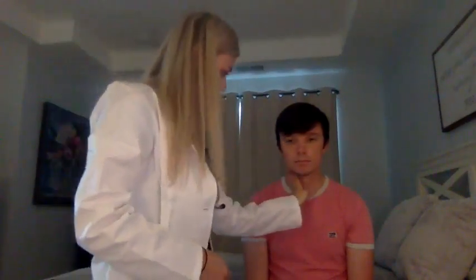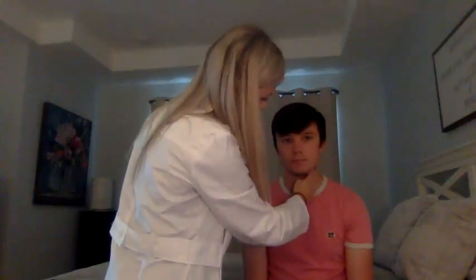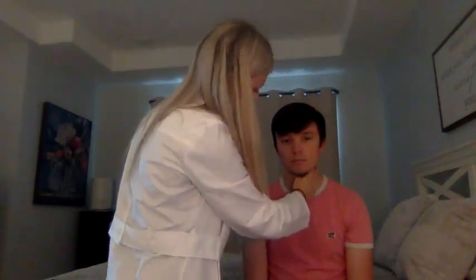Now I will be palpating the carotid arteries one at a time. Okay. Those are both equal and bounding bilaterally. And now I will be auscultating over the carotid arteries. I'm listening for any kind of bruits, and I'll use the bell of my stethoscope to do this.